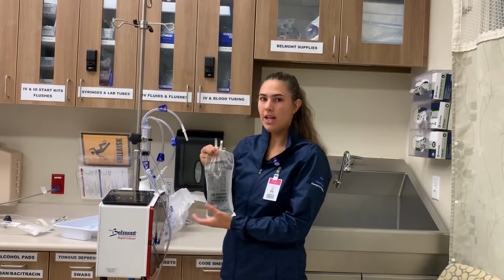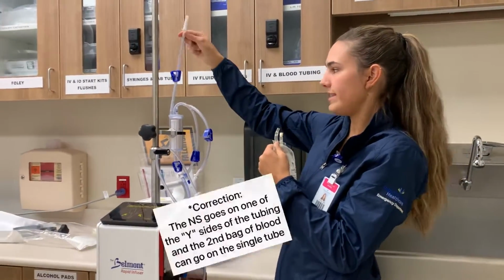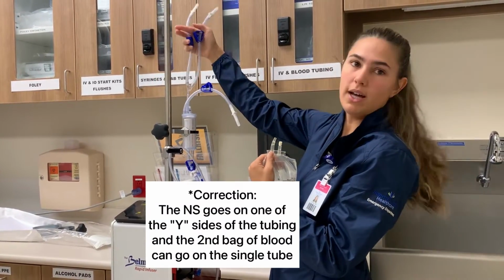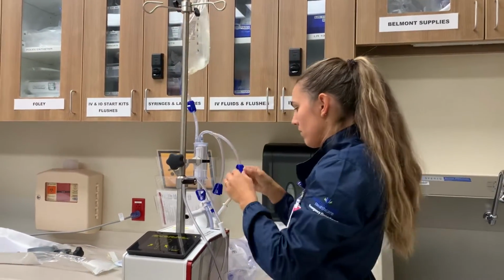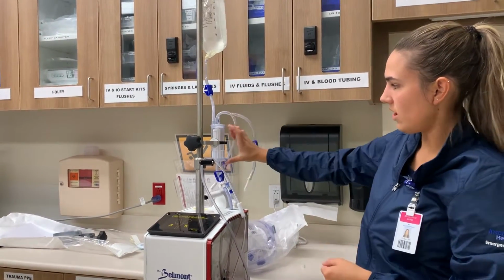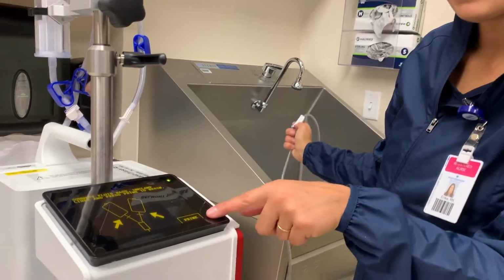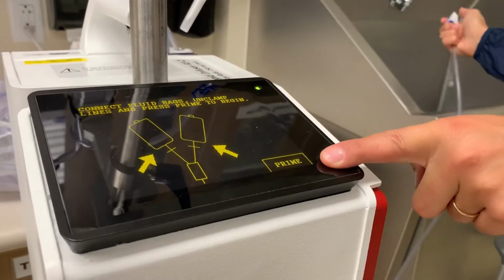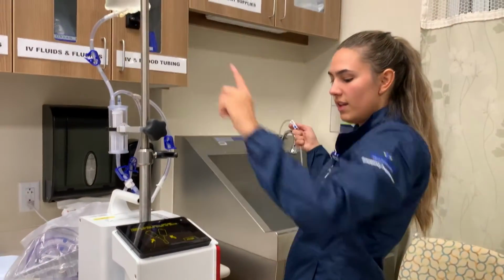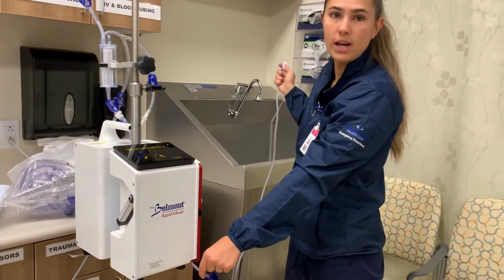Now we can prime our line. We're going to connect the saline to the single side of tubing. This Y side is for blood. And you can see the saline is starting to fill up the chamber. We're going to select prime on the screen right here, and that's going to allow us to prime the entire line from the saline to the bottom here where the tubing comes out of the device.